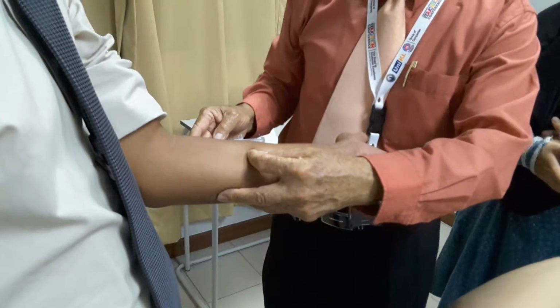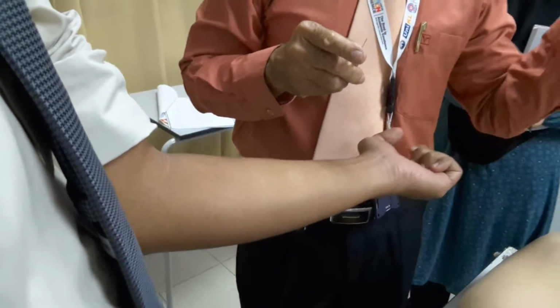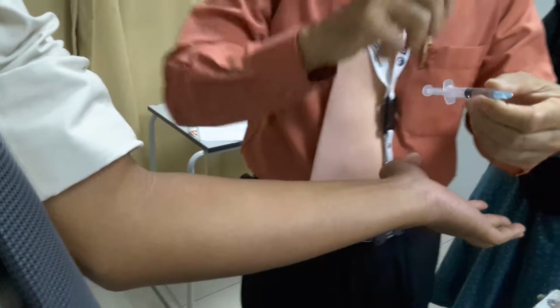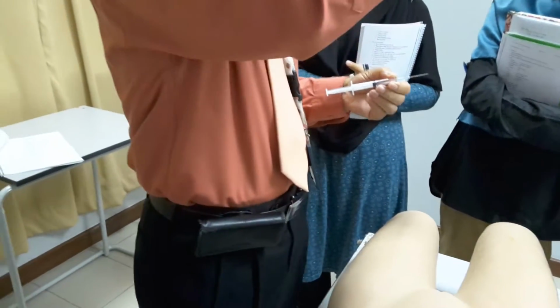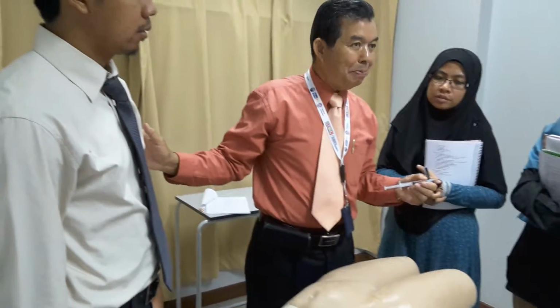Now that is subcutaneous. Another one is we can still do intradermal injection. That means just as it is you inject, and when you pump a little bit you see something like an orange peel effect popping up. Those are the intradermal, especially we use for BCG vaccination. What is BCG? Bacillus Calmette-Guérin. So those are the attenuated tuberculosis. Okay, that's how we do subcutaneous. Okay, done. Thank you very much. Close it.